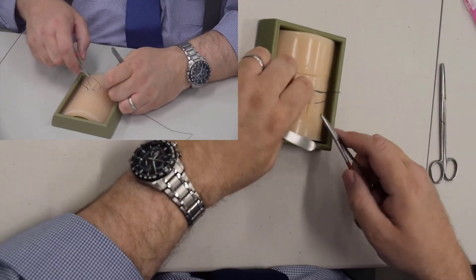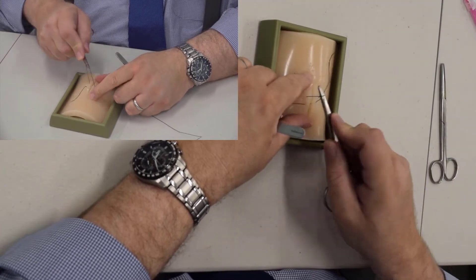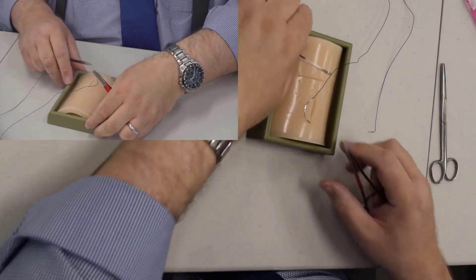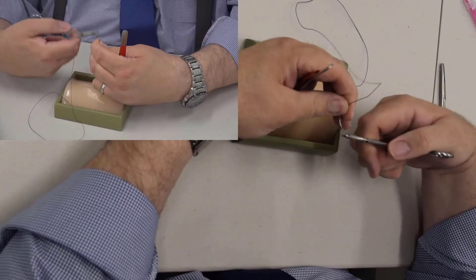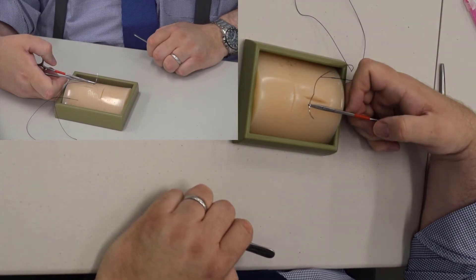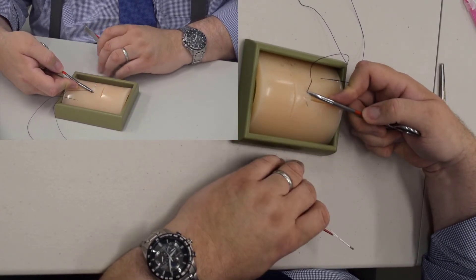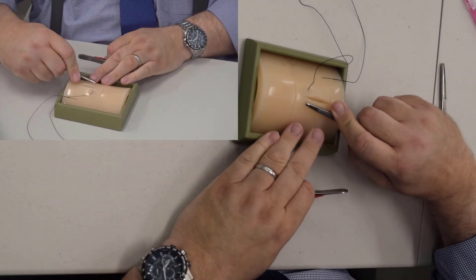I'm going to undo this and pull it through, and show you how to do an instrument tie. This is not a one-handed tie or a two-handed tie — you're literally going to tie the knot with your instruments. Load the needle in the needle driver, right at the very tip at a 90-degree angle. Put your first stitch through, pop open the needle driver — notice my fingers are not in the holes — and pull the needle through.